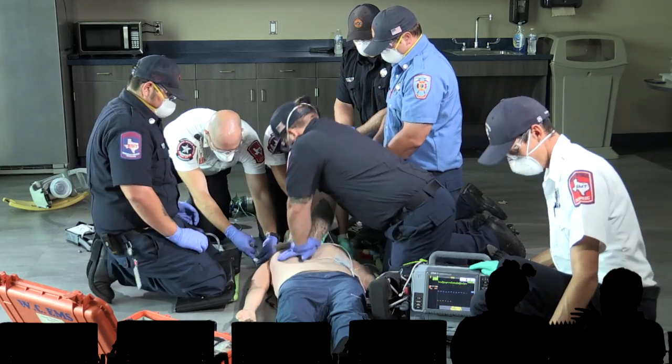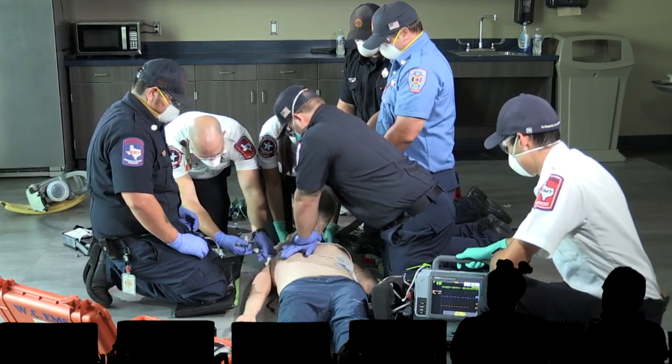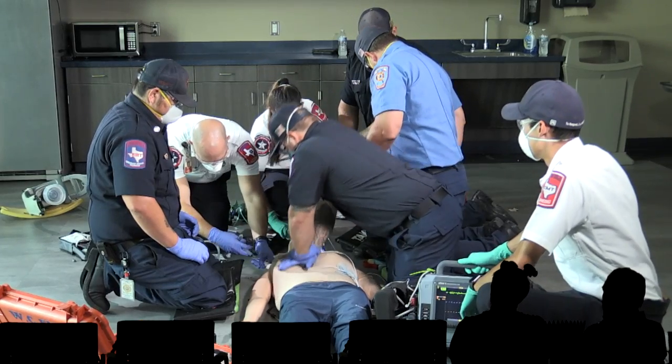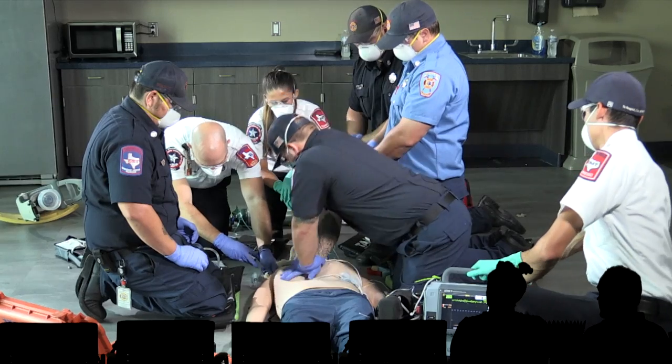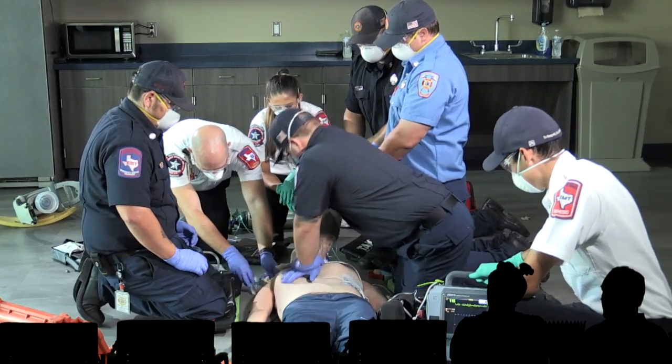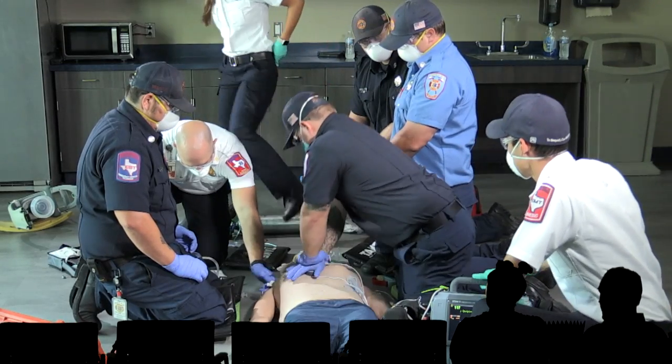Did you notice — no pause, shocked, and got right back on the chest. I like it. Abby was even putting the C collar on and held on for just one second while they shocked and then went ahead and finished it. So she didn't get shocked. It looks like our commander is putting some amiodarone in through that humeral head IO.